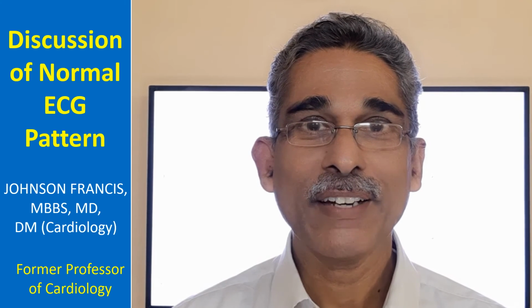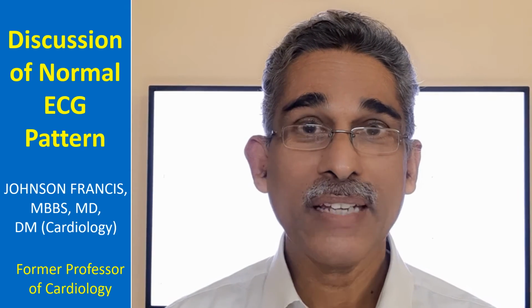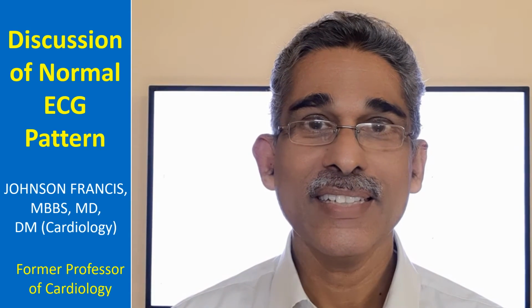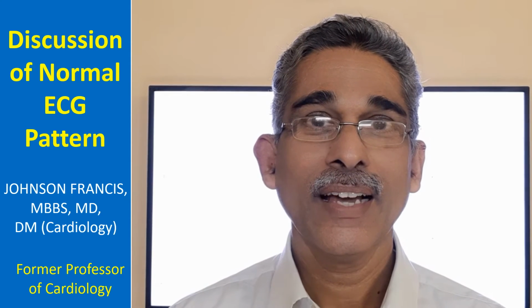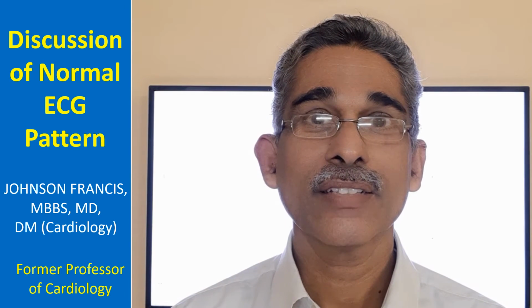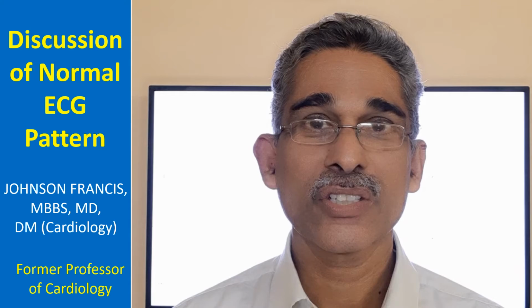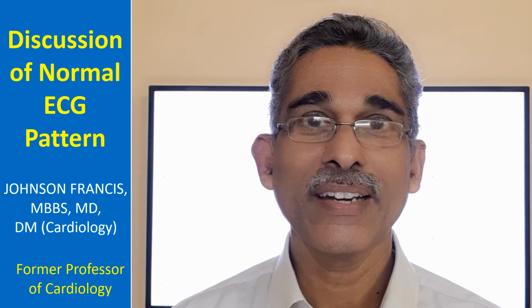Today we will discuss a normal ECG. If you want to analyze an abnormal ECG, first you should know what a normal ECG is and what the patterns of a normal ECG are, to analyze the P wave, QRS, everything in a sequence. You have to identify a normal ECG first. So that's why this session on a normal ECG has been included.